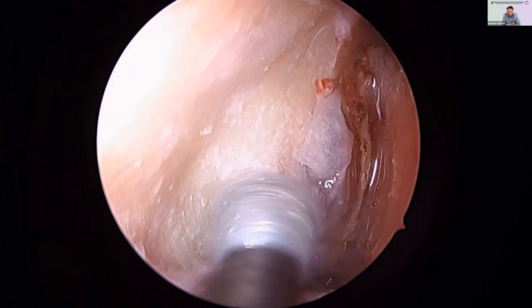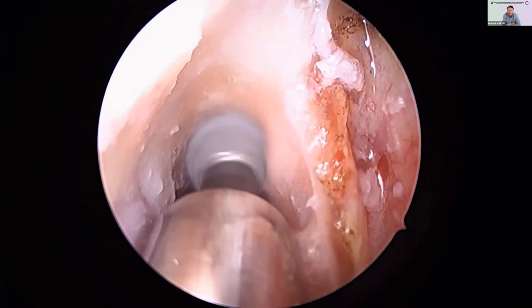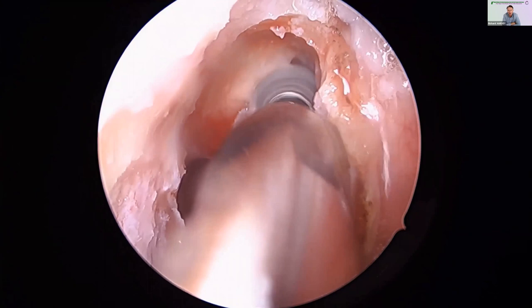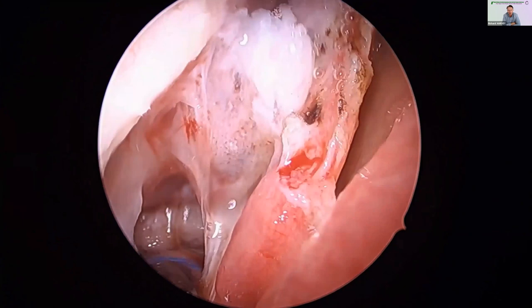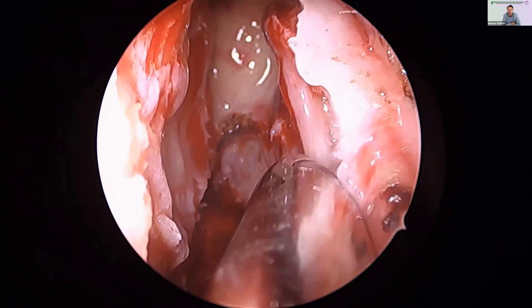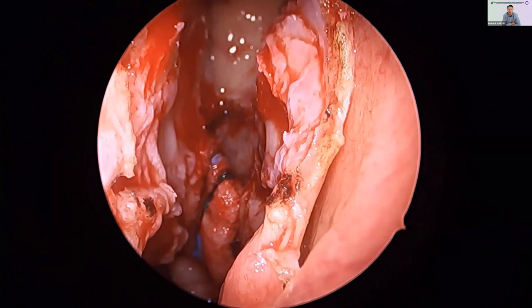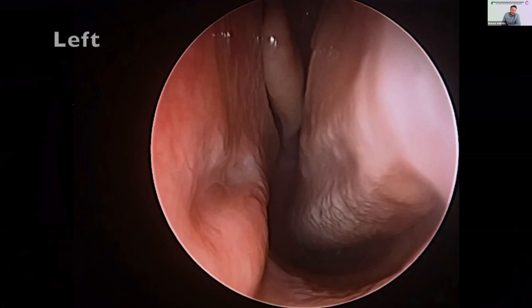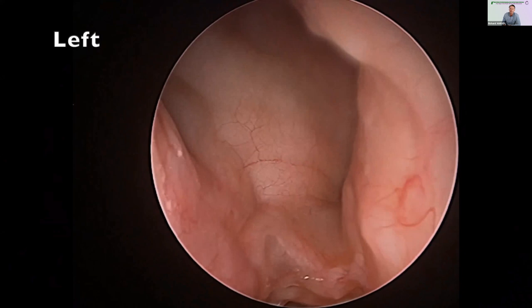Having the flap out of the way and exposing this area makes the drilling really easy. Now that the flap is so big and broad, you're exposing more bone than you actually need for the drill, but you get this lovely view with the flap. Showing our evolution of approach gives you a better idea of what we need to drill here. You can see this gentleman's got a great-looking sinus cavity. We're using a shaver, and the flap gets returned. The whole thing's done with a zero-degree scope — it's not a Lothrop; it's really just a Draf 2A, but done where the entire axilla is removed.